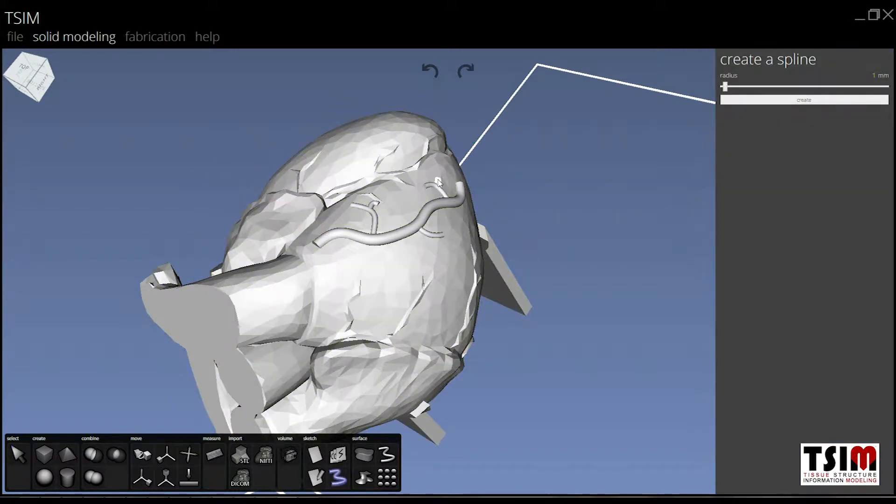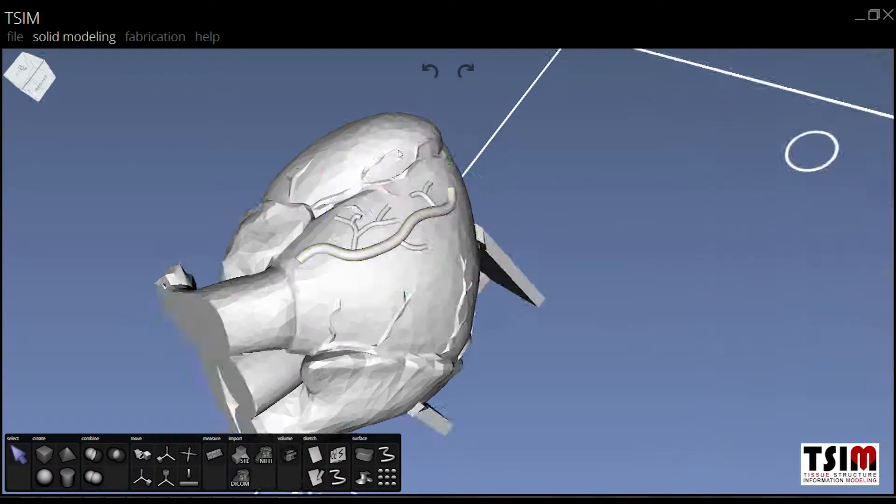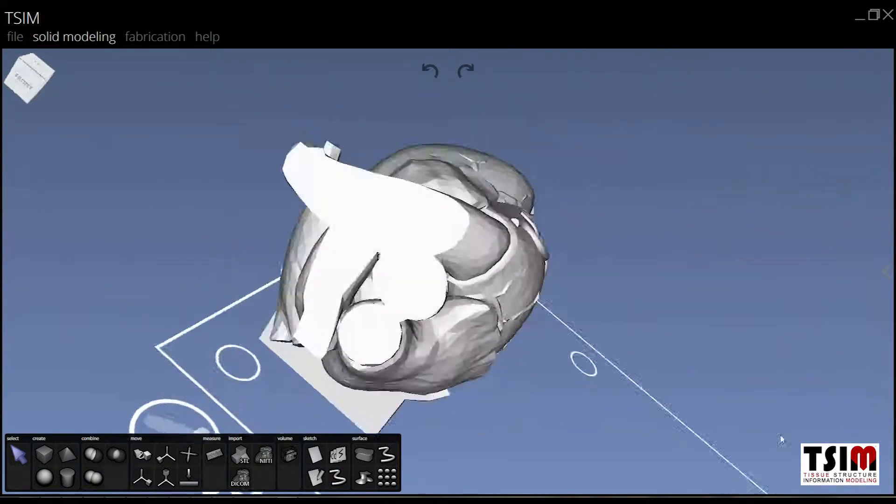Once constructed in TSIM, the model, including the added vascular tree, is then sent over to the BioAssemblyBot.